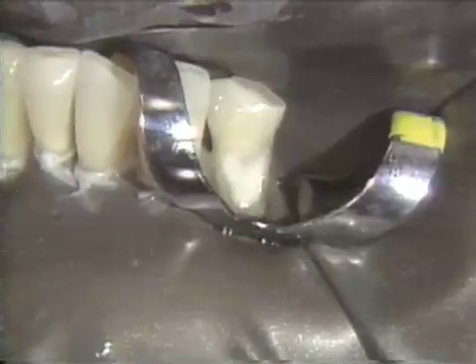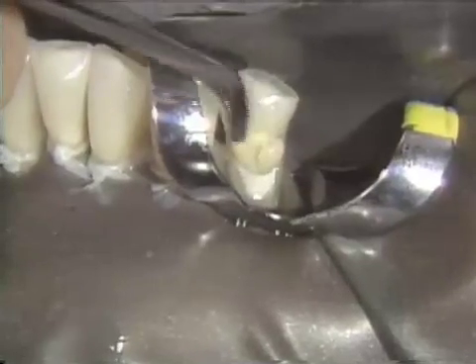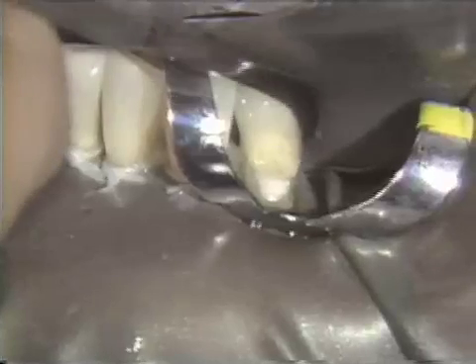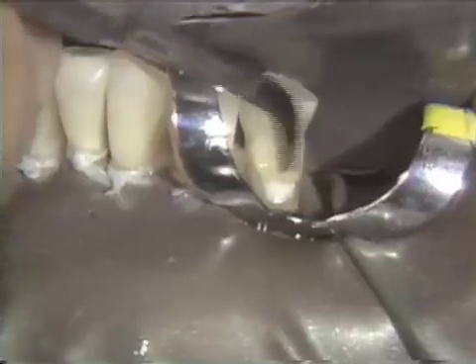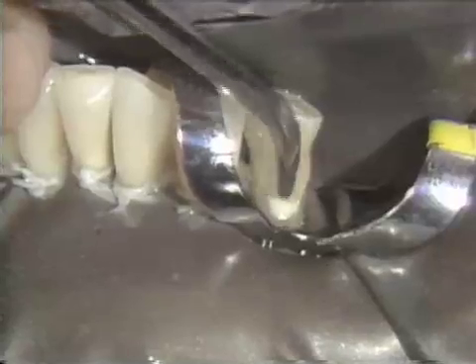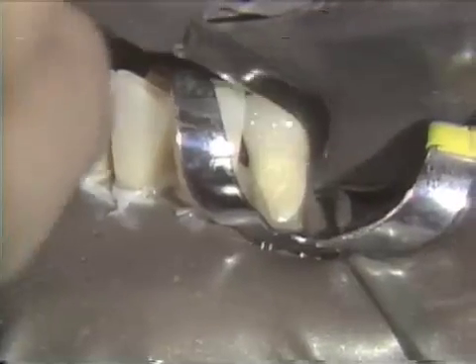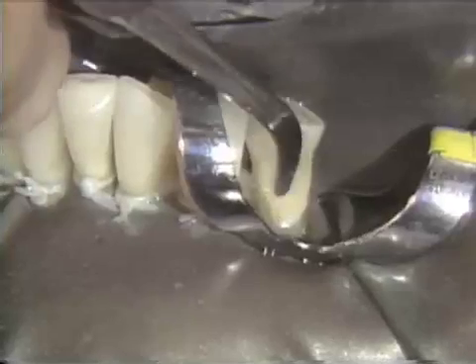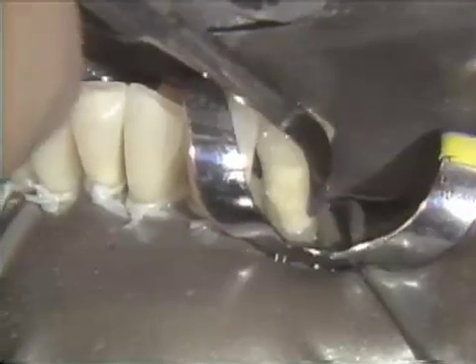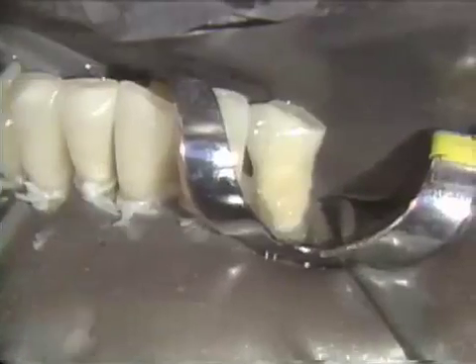Because of the thickness of this restoration, composite is placed in layers to minimize shrinkage away from the margins. No alcohol or solvent should be added to the contouring instruments when handling the new generation of posterior composites. Contaminants will affect the physical properties of the restorative material and will weaken the final restoration. The new generation of posterior composites with better handling characteristics may be handled without them by adapting the composite toward the margin.